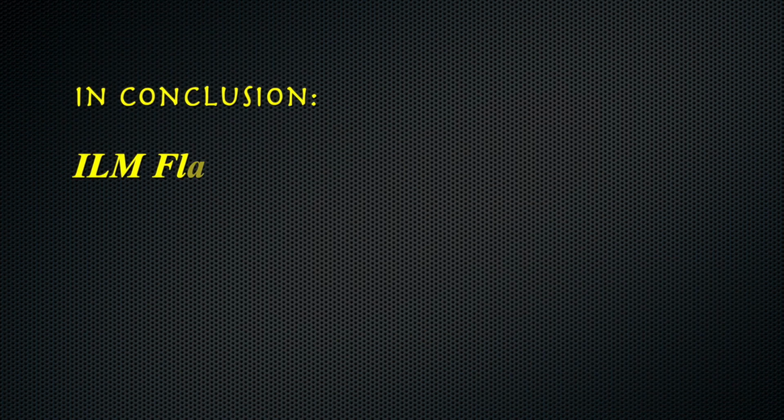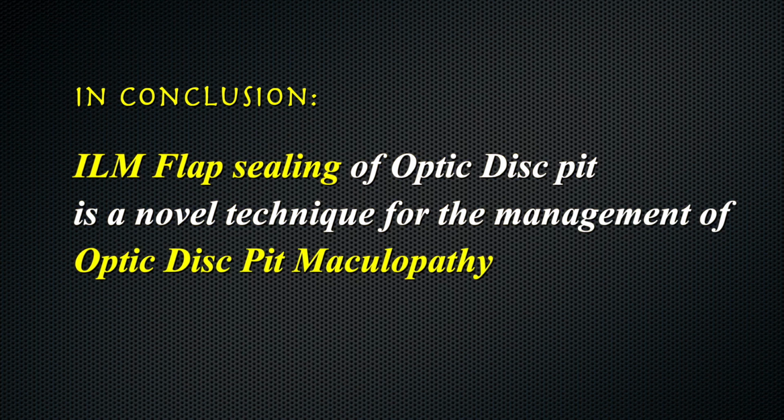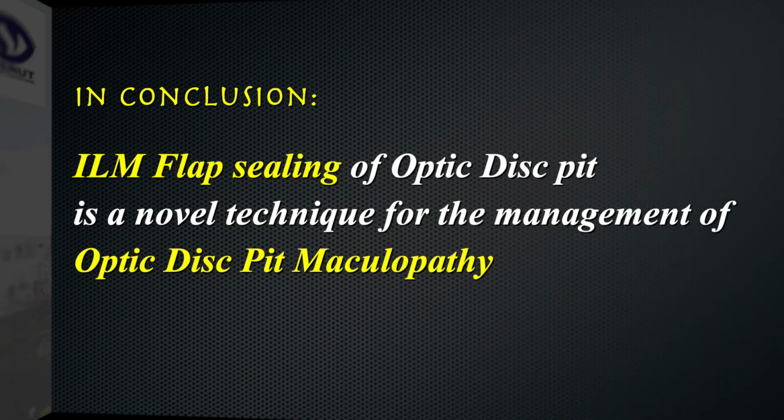So we can conclude that ILM flap sealing of the optic disc pit is a novel technique for the management of optic disc pit maculopathy.